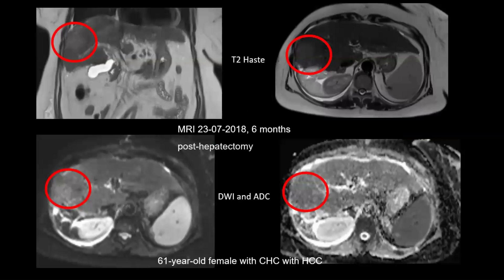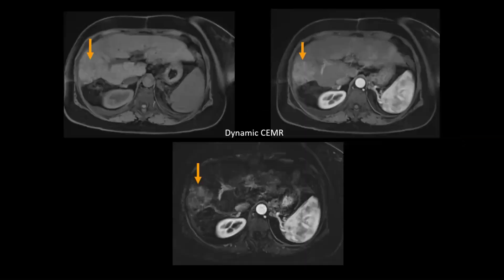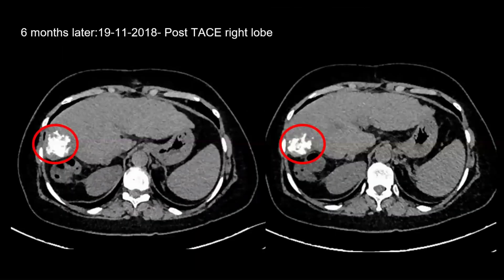Case scenario one is a post-resection recurrence: a 61-year-old female with chronic hepatitis C and HCC who had undergone resection for a tumor in the right lobe of the liver. The T2 HASTE and diffusion-weighted images show the recurrent tumor in the circle, which is hyperintense and shows diffusion restriction. The dynamic CMRI shows arterial enhancement of this recurrent tumor. This was treated with TACE, and the post-TACE image shows good uptake within the recurrent tumor.